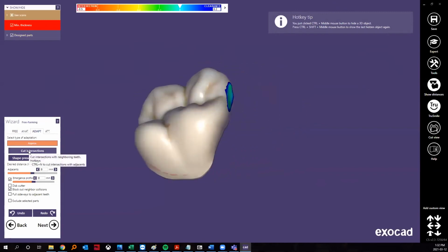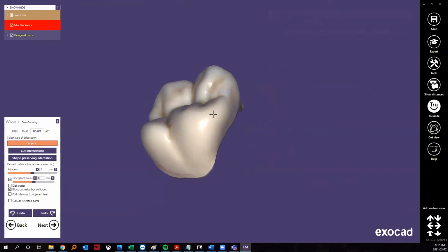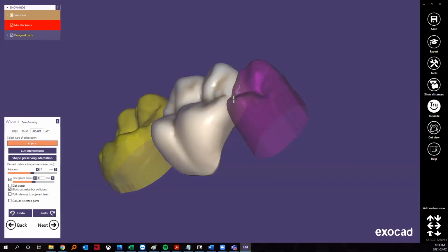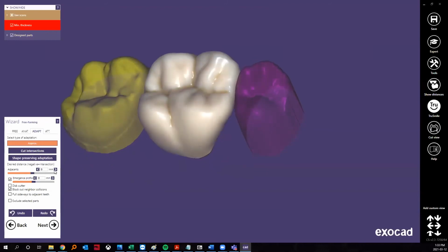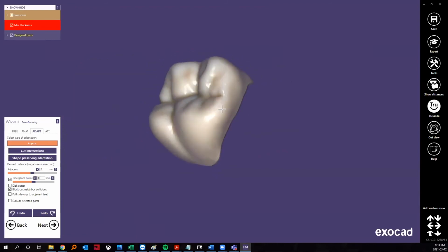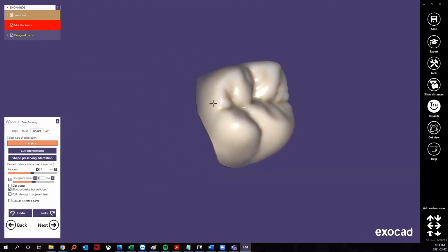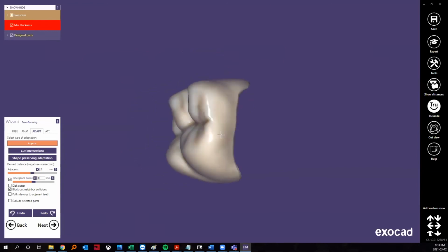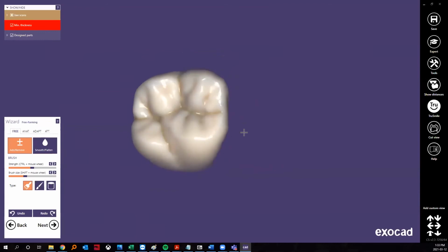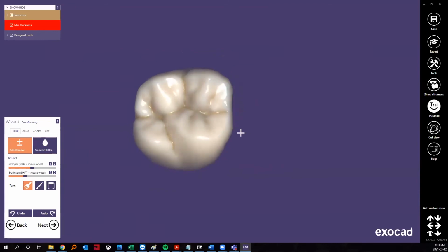I can go to cut intersections. I'm going to hide the map so we can see the actual effect it does. See, it's showing us the adjacent teeth. And now I have that contact and it's set to 0. So I'm right at 0. And I actually don't have any concavity, so I set it up pretty nicely. But if I want, I can come back and smooth these areas, right? So you can see here, it carves in.